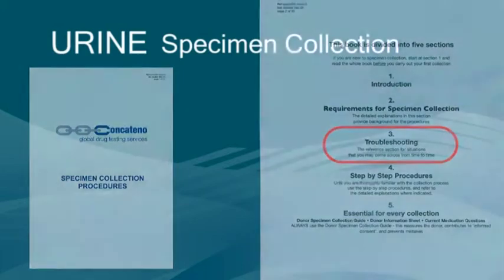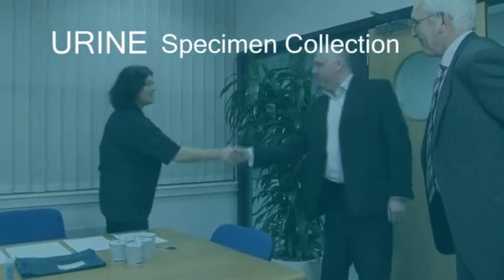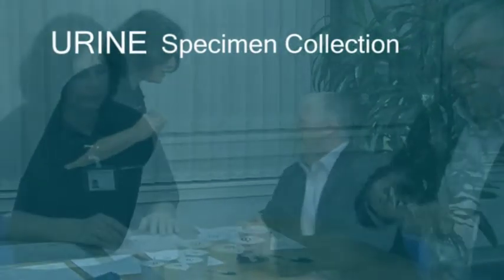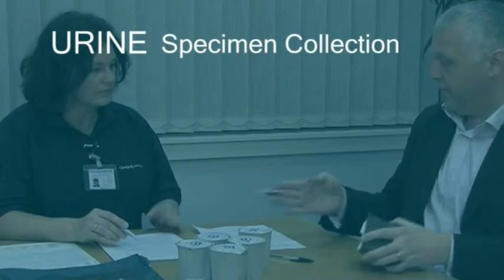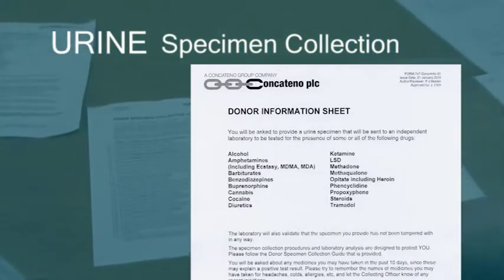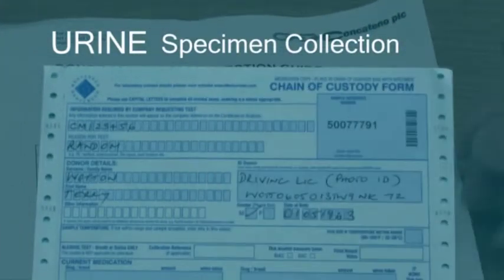We will now run through a collection from start to finish. Greet the donor. Show your ID and ask to see theirs. Explain the checklist and ask them to read the donor information sheet. You will have instructions on how to complete the customer information section of the chain of custody form.